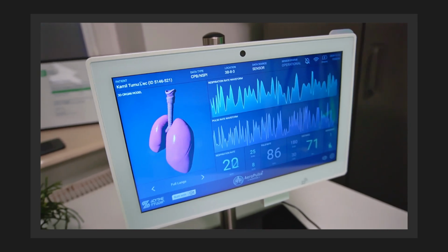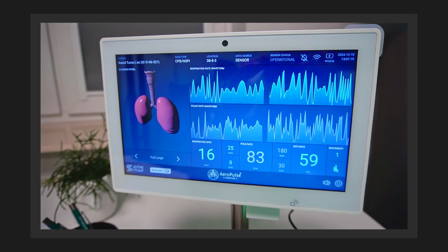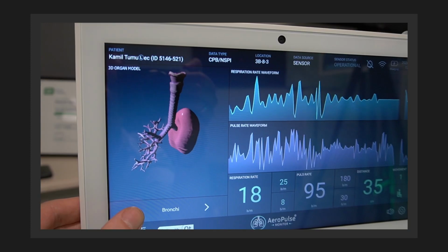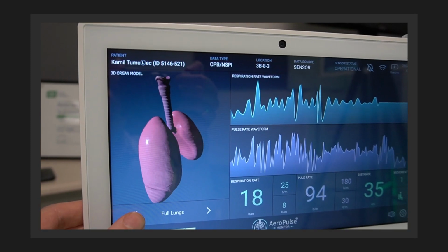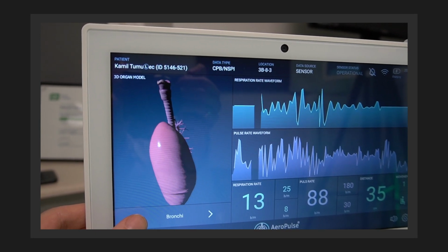Customer wanted to reach the market as soon as possible, so to simplify the process, they decided to go with a ready out-of-the-shelf solution for the device, for the tablet, so they don't have to spend more time on engineering and applying all regulatory requirements. So here the choice of the operating system was limited by the manufacturer of this medical tablet.